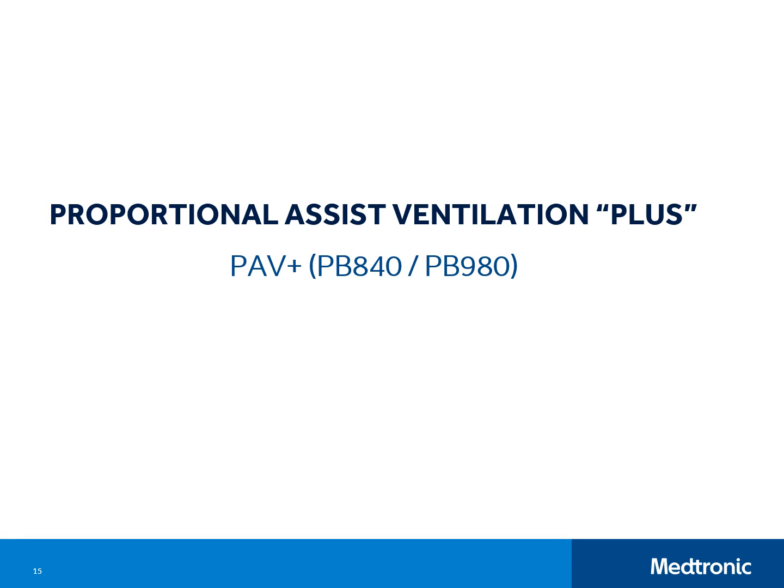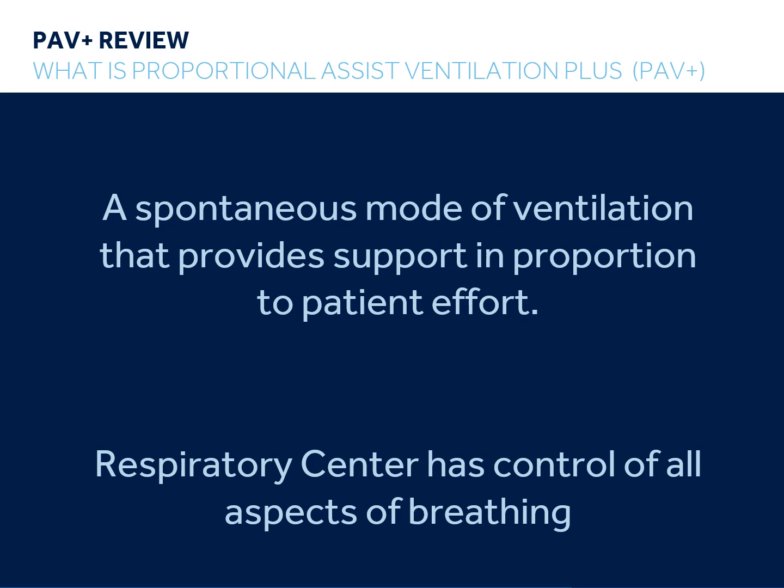Now that we've reviewed pressure support ventilation, as well as some of the challenges in trying to assess or maintain normal patient effort in pressure support, we will now introduce proportional assist ventilation on the Puritan-Bennett PB840 or PB980 ventilators. Proportional assist ventilation is a spontaneous mode of ventilation that provides support directly in proportion to patient effort.